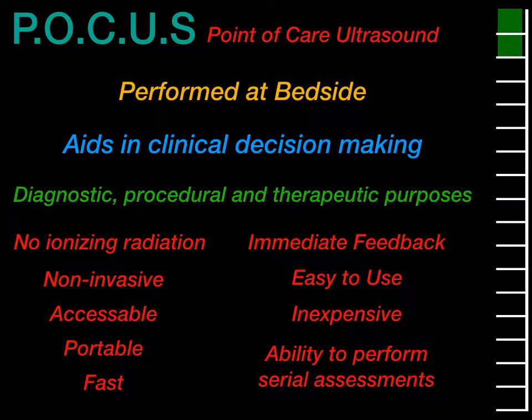You can use it for immediate feedback on procedures you wish to perform through ultrasound guidance. It's easy to use with a little bit of training and practice. It's inexpensive and becoming more affordable every day. And importantly, in trauma situations, you can perform serial assessments on patients you wish to follow throughout their clinical course in order to provide the best care possible.